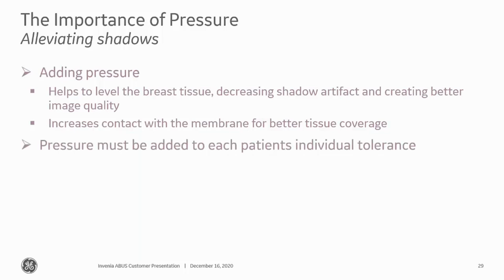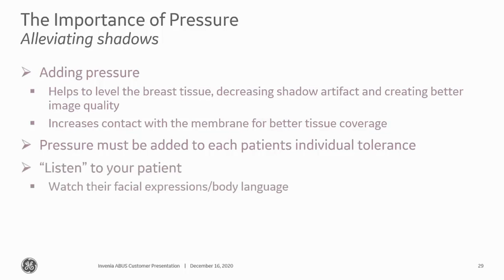Pressure can be added according to the patient's individual tolerance. So again, watch their facial expression and their body language. Don't push it too much. Listen to the patient. Let them know that they can tell you if something's uncomfortable, and then you can back off the pressure.